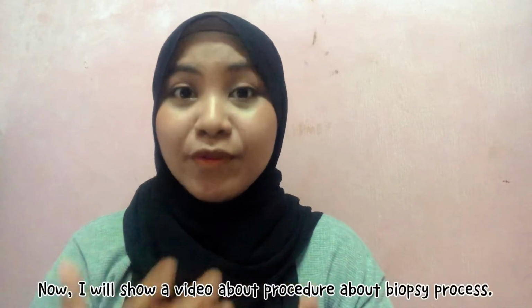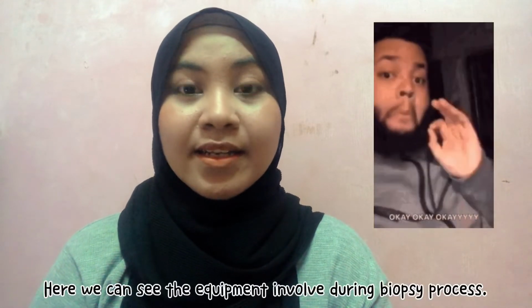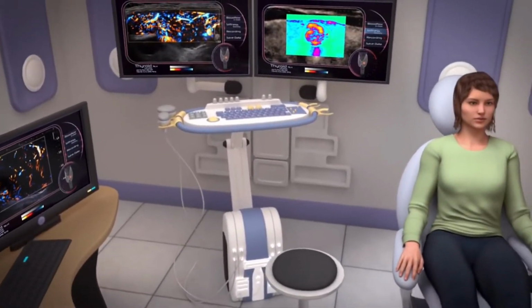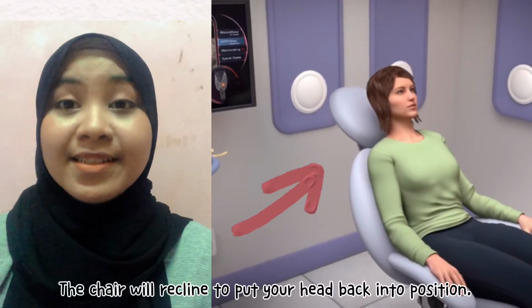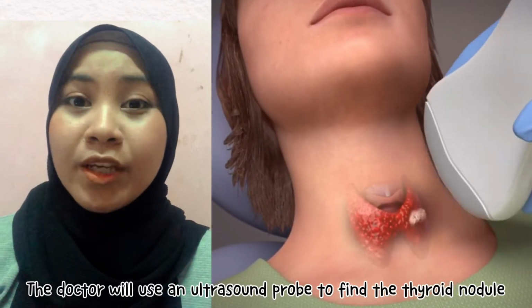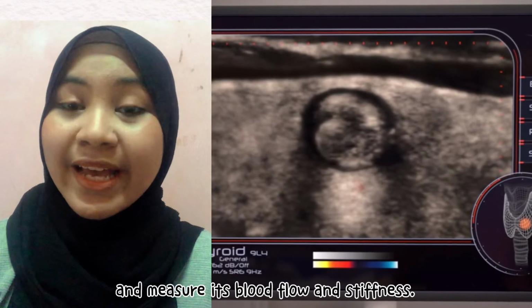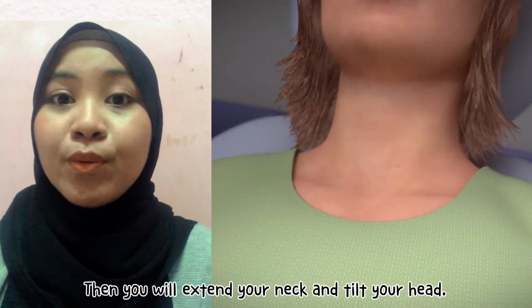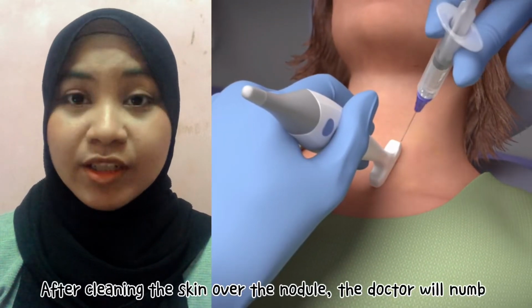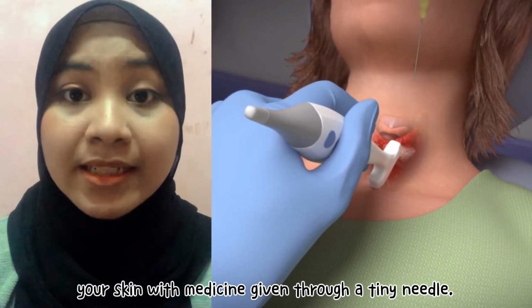Now, I will show you a video about the procedure during the biopsy process. Here, you can see the equipment involved during the biopsy process. The chair will recline to put your head back into position. The doctor will use an ultrasound probe to find the thyroid nodules and measure its blood flow and stiffness. Then you will extend your neck and tilt your head. After cleaning the skin over the nodules, the doctor will numb your skin with medicine given through a tiny needle.